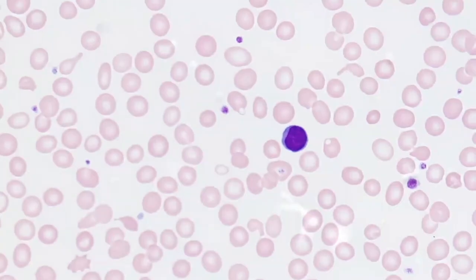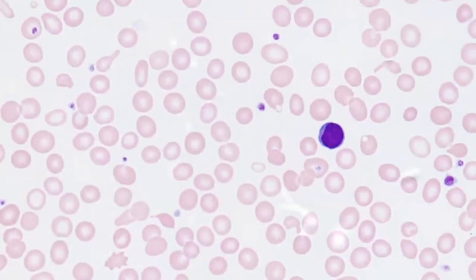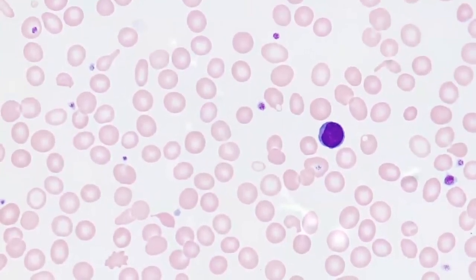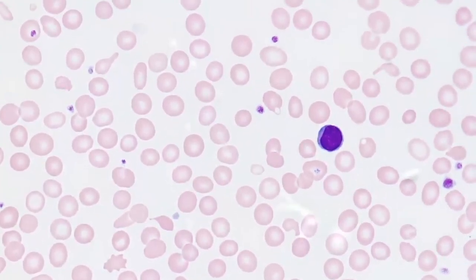At 100x, we can see that the red cells may be smaller than usual. There's one here in the center of the screen that really would be smaller than we would think of as normal. A good reference, if you're wondering whether a red cell is too big or too small, is to look at a normal mature lymphocyte nucleus. Typically red cells are the same size as the nucleus of a mature lymphocyte.